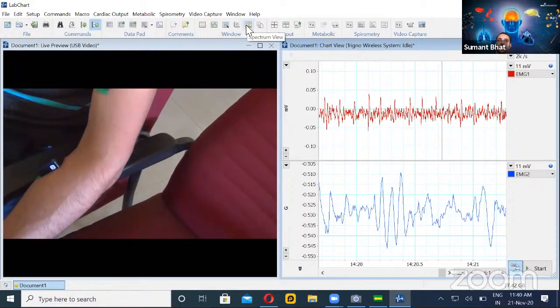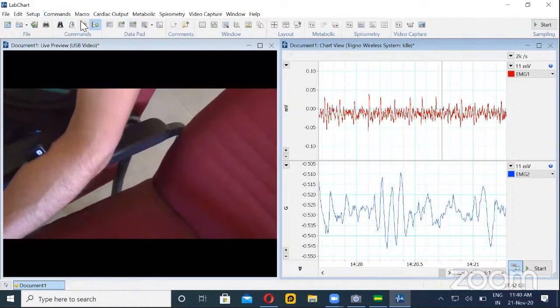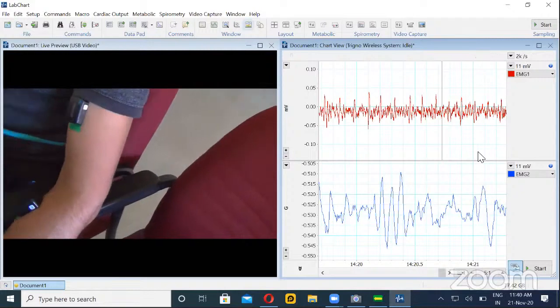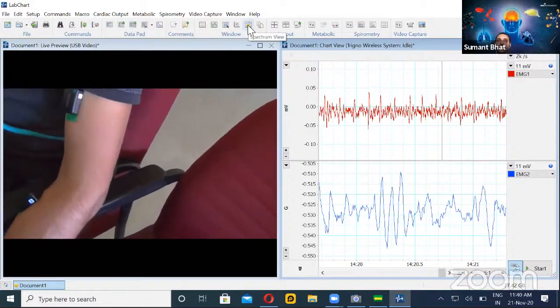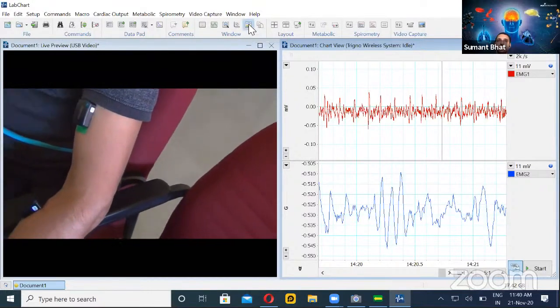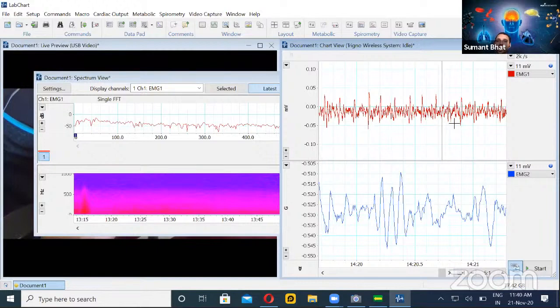Before moving on, let me show the spectrum view. The chart view we have seen shows amplitude versus time. But if we want to look at the frequency component of the data, we have the spectrum view. We can decide which channel to observe from the top dropdown — currently it is set to display EMG one. You can also go to settings to set the parameters for the FFT.